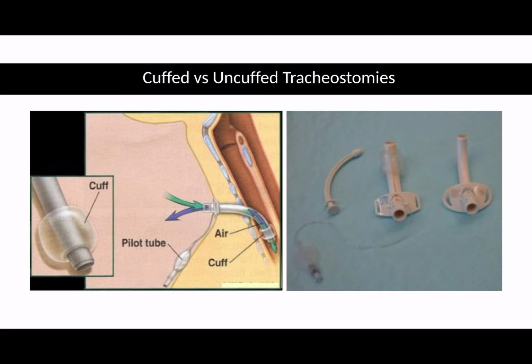So if the patient's spontaneously breathing and has got a patent upper airway, i.e. they have not had a laryngectomy, you can get air being entrained through the mouth and down the trachea, as well as through the tracheostomy. Similarly, when the patient's exhaling, you will get air coming out of the tracheostomy and also out through the sides of the tracheostomy.